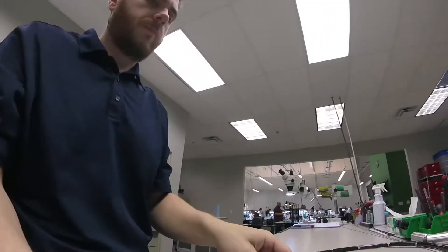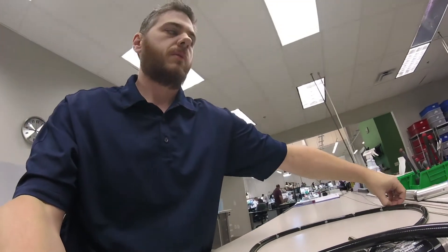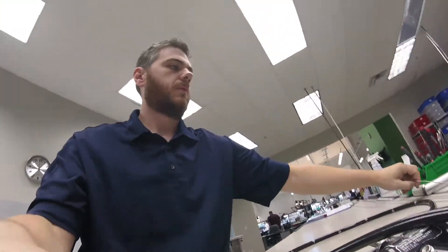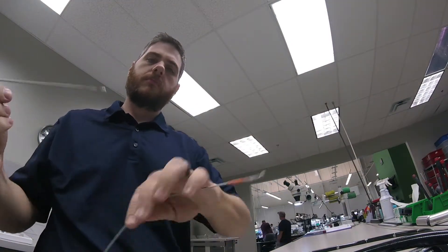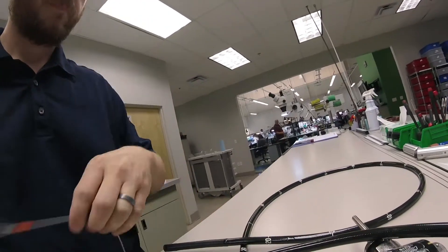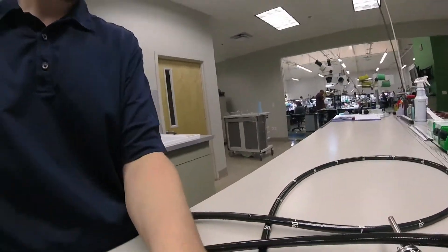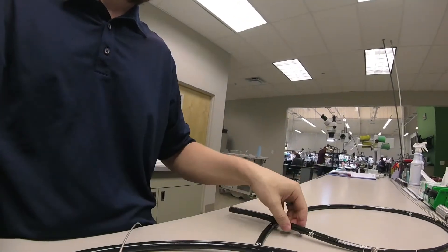The technician starts off by performing the initial inspection of the scope. Next, the technician examines the scope to ensure it operates according to original manufacturer specifications. During this stage in the repair process, the technician checks to see if angulation is within tolerance, the image works, the channels are clear, and no leaks exist anywhere in the scope.